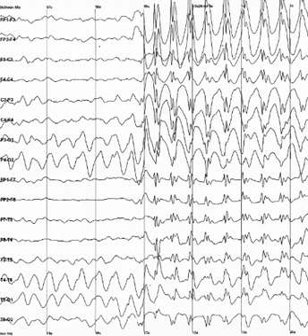Normal activity. The EEG is typically described in terms of 1) rhythmic activity and 2) transients. The rhythmic activity is divided into bands by frequency. To some degree, these frequency bands are a matter of nomenclature, i.e., any rhythmic activity between 8 to 12 Hz can be described as alpha. But these designations arose because rhythmic activity within a certain frequency range was noted to have a certain distribution over the scalp or a certain biological significance.